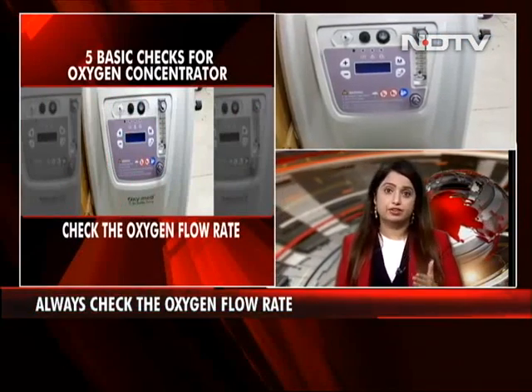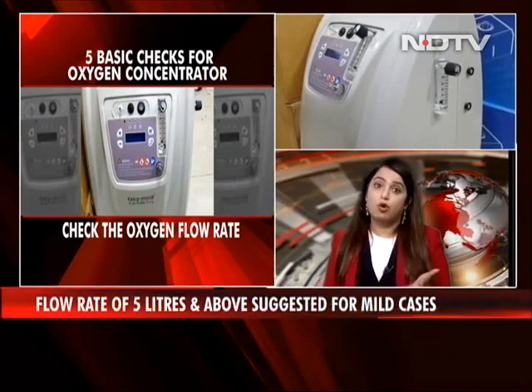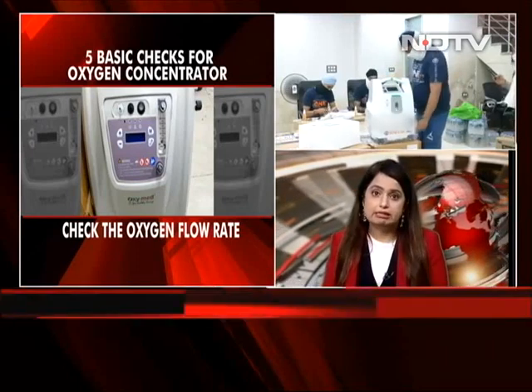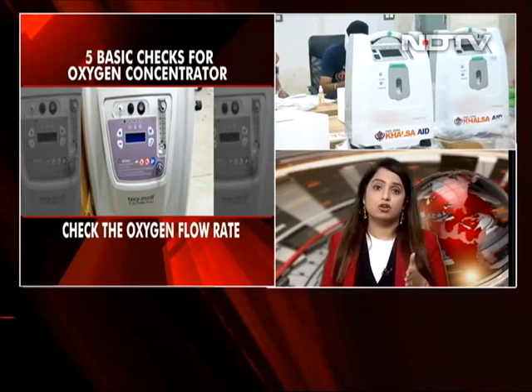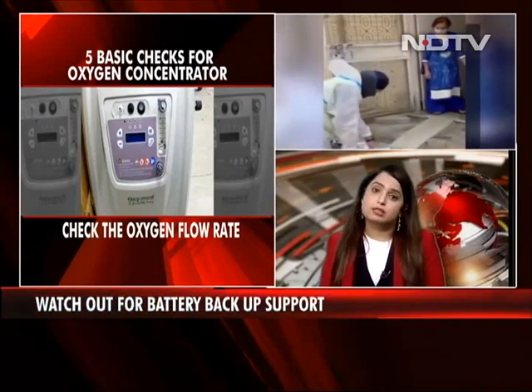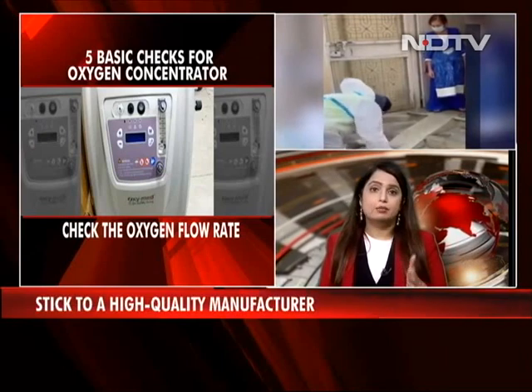Second, check the oxygen flow rate. Now, this is really critical. You also need to keep in mind the oxygen flow rate when buying or renting a concentrator. A flow rate of 5 liters per minute and above is recommended for mild cases. This is the minimum guaranteed amount of oxygen provided by the concentrator and can make a significant difference in patient recovery. You may consider a 10 liters per minute concentrator that can be used to support 2 patients simultaneously.